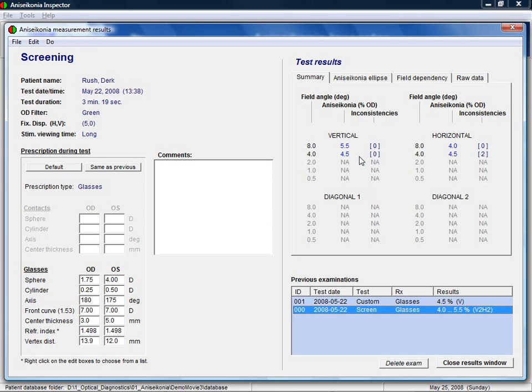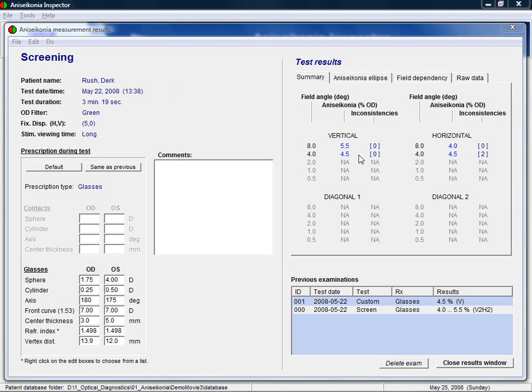Especially with retinally induced aniseikonia, such as with an epiretinal membrane or retinal detachment, the aniseikonia may change as a function of field angle. The aniseikonia in this case was approximately 4 to 5%. The numbers in between brackets are the inconsistencies made in the measurements.